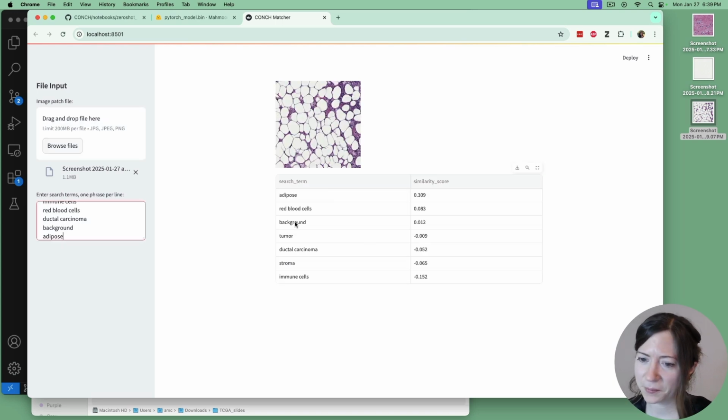Yeah, doing a really good job here. So that's pretty awesome. I think it's done very well, and it's nice to have a little interface here to interact with.